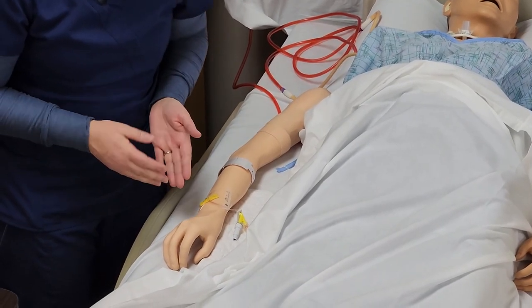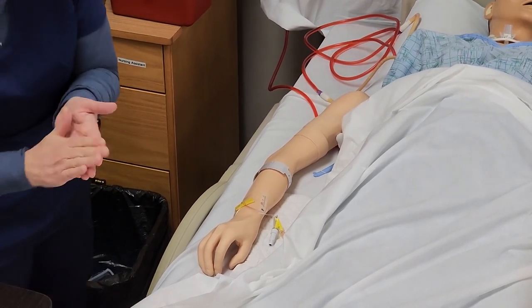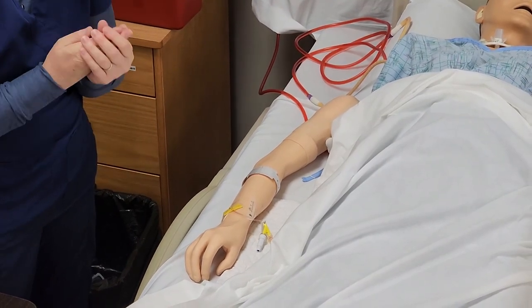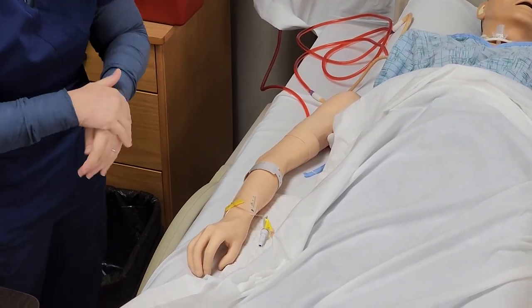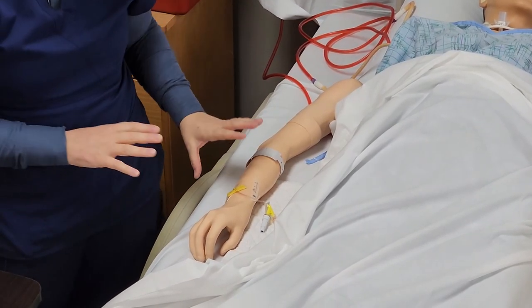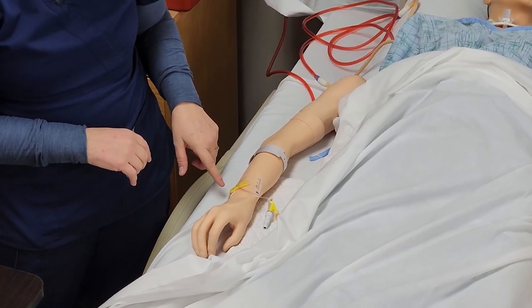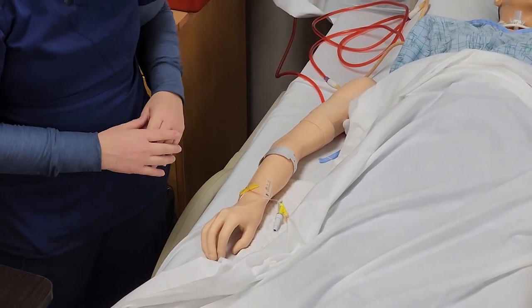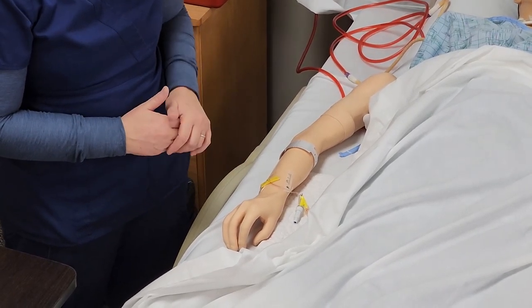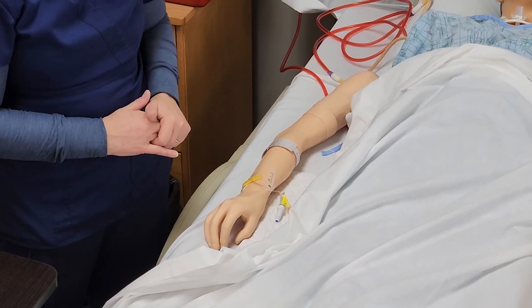I have the IV saline lock here and all my supplies, so I'm going to wash my hands one more time. As I look at the IV site, I'm assessing it — making sure it looks okay on inspection, which it does. The site is clear, the IV is intact, the dressing is also intact. I don't see any drainage, erythema, or swelling that may indicate infiltration or infection.